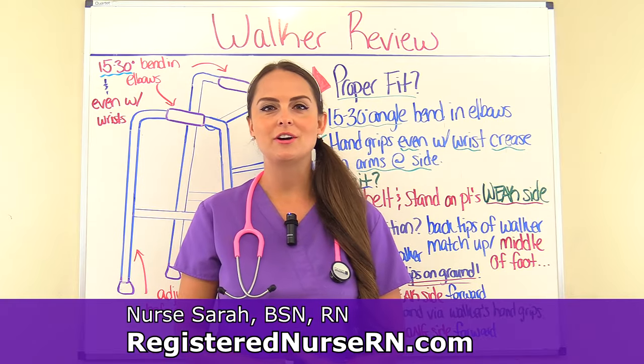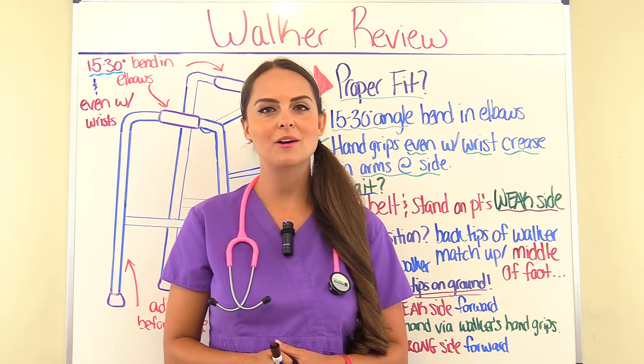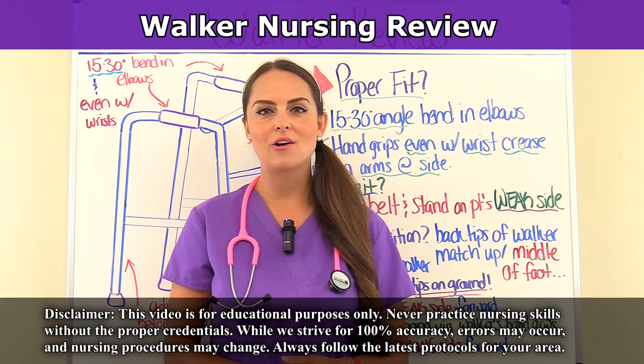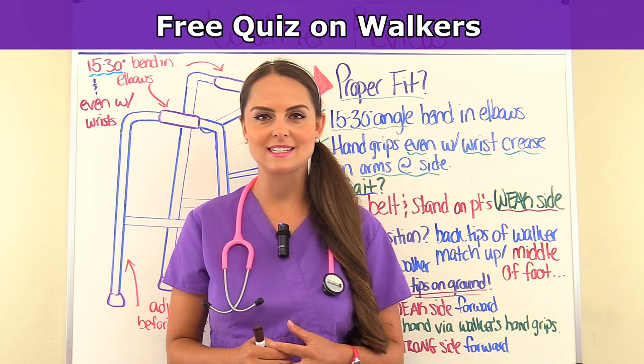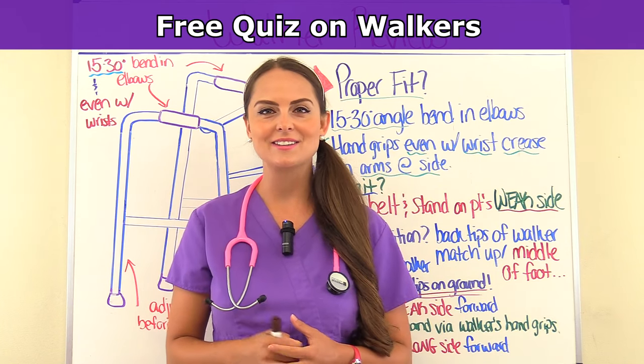Hey everyone, it's Sarah at RegisterNurseRN.com and today we're going to talk about walkers. When you get done watching this video, you can access the free quiz that will test you on this assistive device. So let's get started.